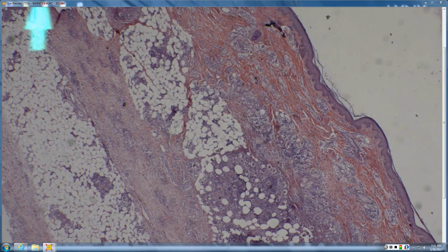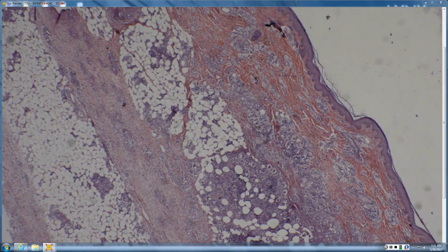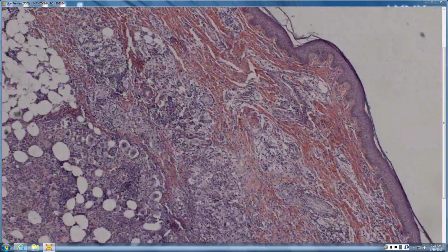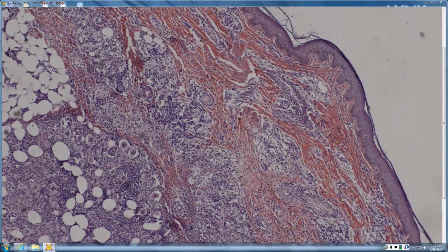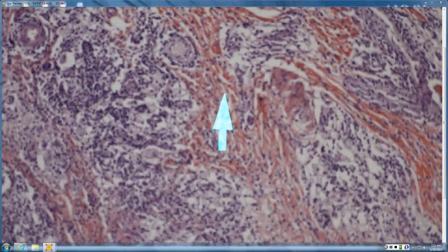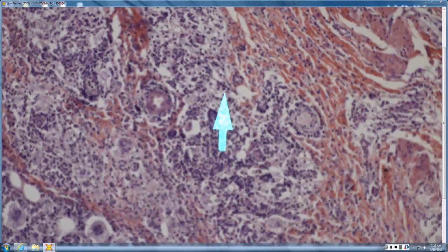So the whole specimen speaks of something infectious that's maybe been going on for a while, so more of a chronic thing. And Erythema nodosum leprosum is this leukocytoclastic vasculitis that's superimposed onto leprosy and the lymphohistiocytic, and sometimes a little granulomatous, reaction that you get. Up here there might be some faint findings of classic leukocytoclastic vasculitis, but it's more of a chronic LCV. So kind of like granuloma faciale in a sense, you may not necessarily see an obvious vasculitis.